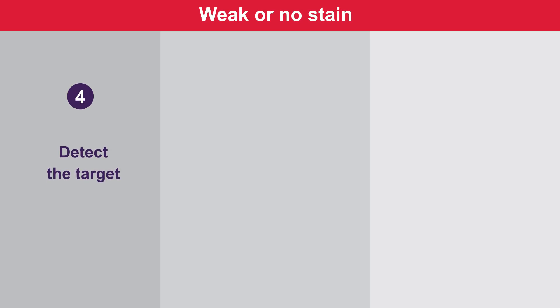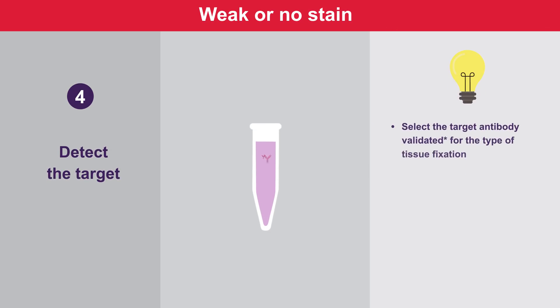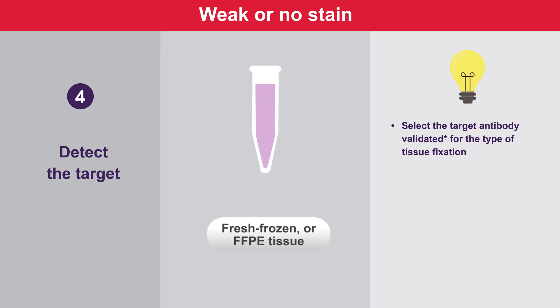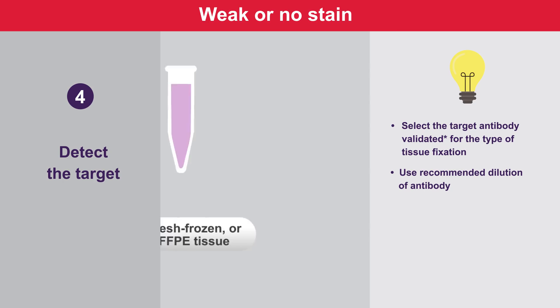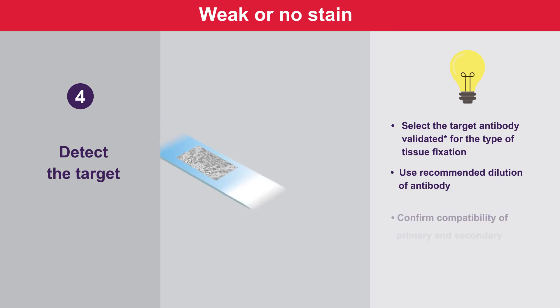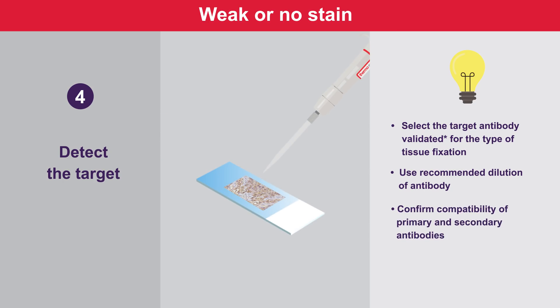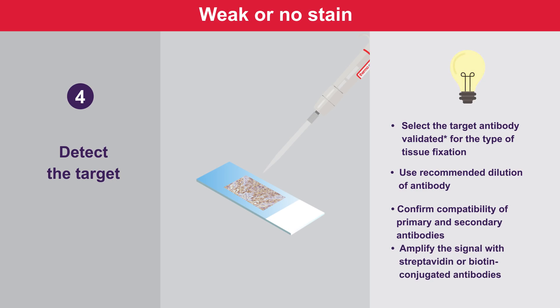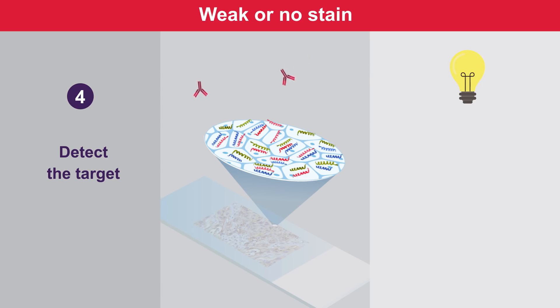For the target detection step, make sure the antibodies are suitable for the type of IHC to be performed, whether fresh frozen or formalin-fixed paraffin embedded, and follow the dilution recommendations. Confirm compatibility of primary and secondary antibodies. Amplify the signal if using a biotin-conjugated secondary antibody and a conjugated streptavidin. Troubleshoot concentration changes and check signal strength.